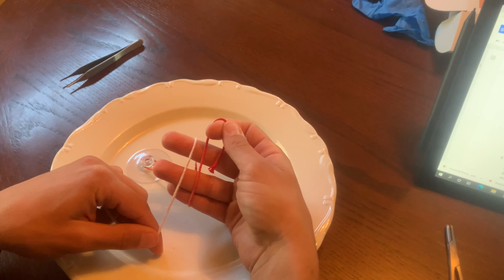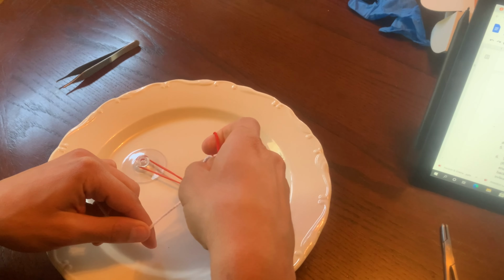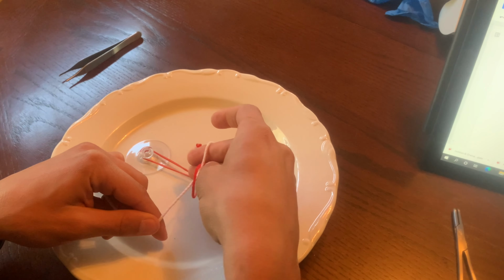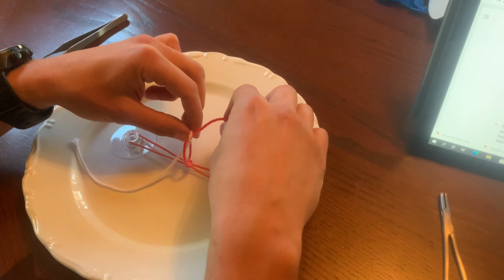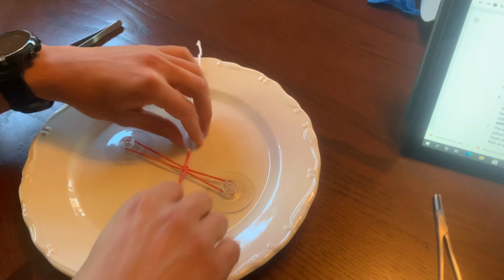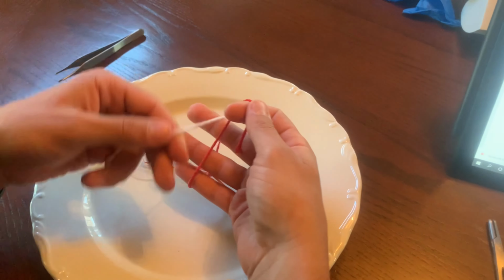Next, with the middle finger, hook the long end and pull it under the short end. Re-lengthen the middle finger and hook the long end and pull it under the short end. We're gonna do that one more time for you. I'm gonna slow it down, keep going. So we're gonna slow this down.